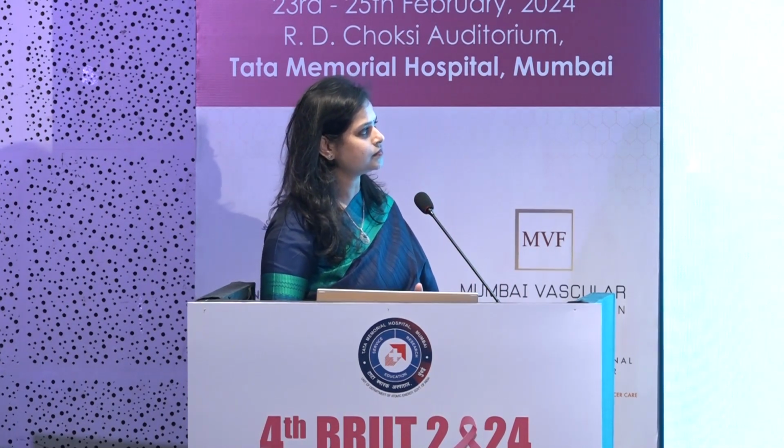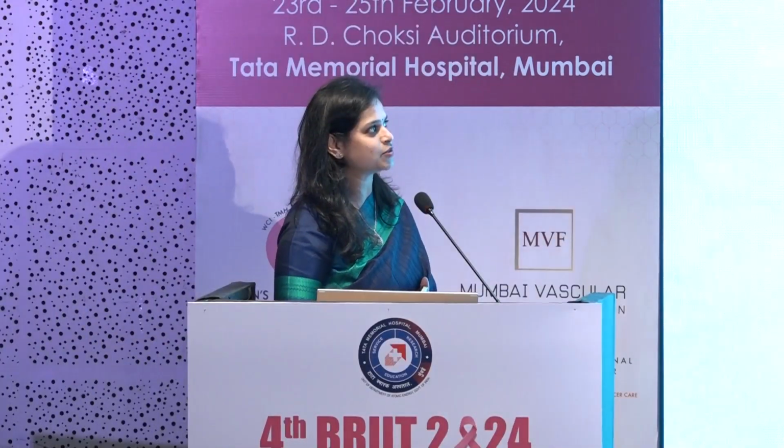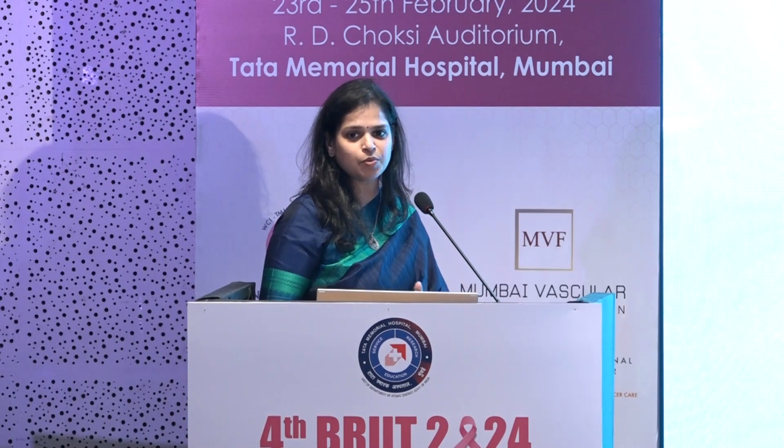So what we do is we put a vitamin E capsule in the center and concentrically roll a gauze piece around it. This is the way we can make a small CC marker. Wrapping it concentrically gives it the center location within the grid, so the measurements are going to be more accurate. It replicates a CC marker.